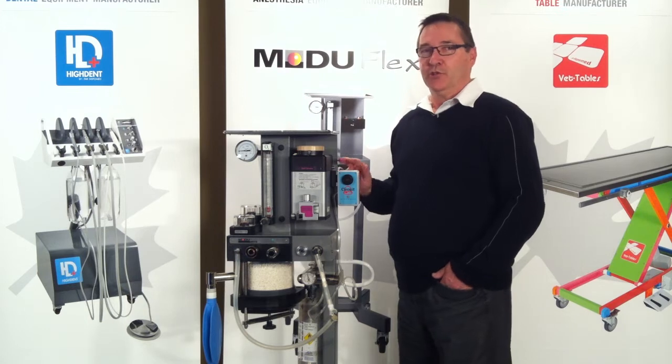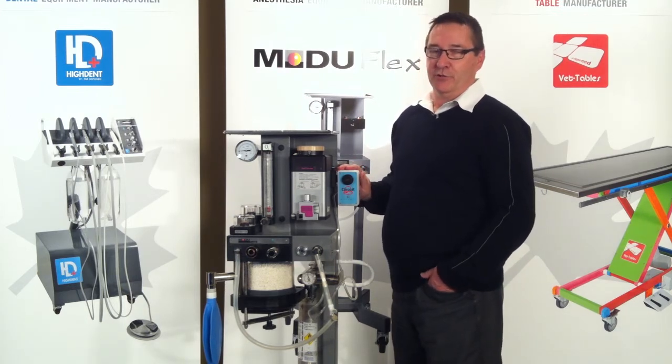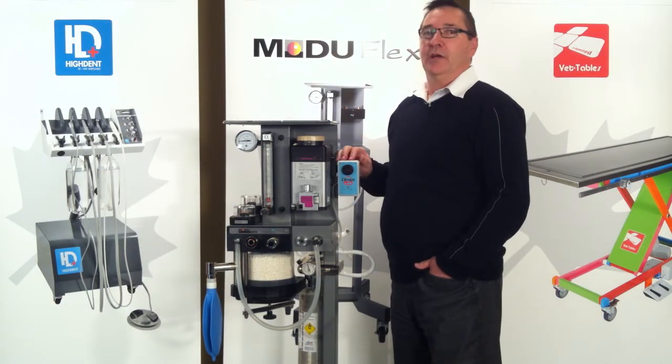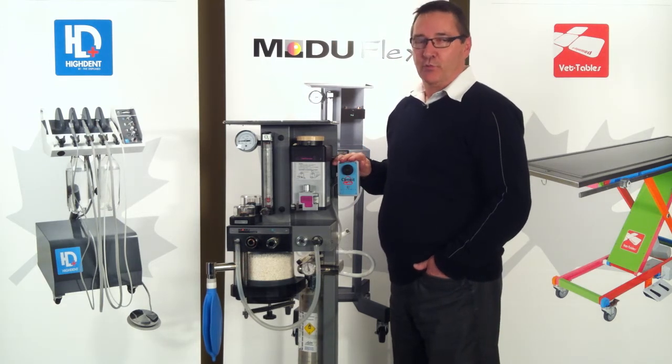Today we will talk about patient circuit pressure alarms, how to install them and how to use them. Patient circuit pressure alarms are used to help notify you in case of a pressure reaching a dangerous point.